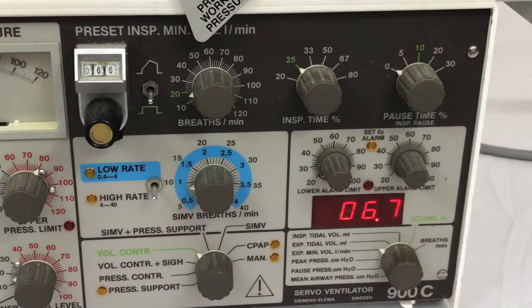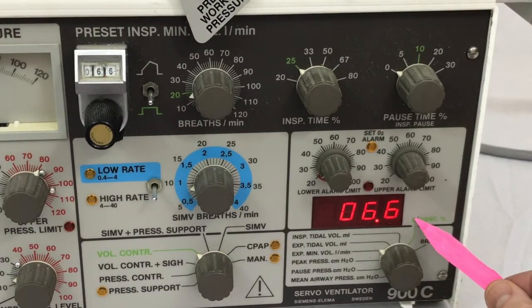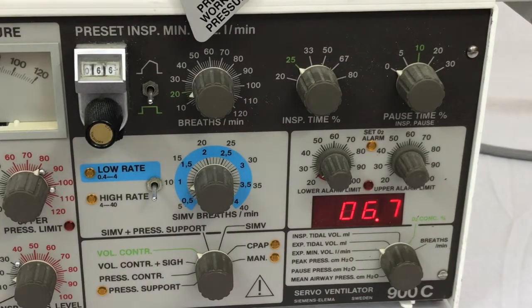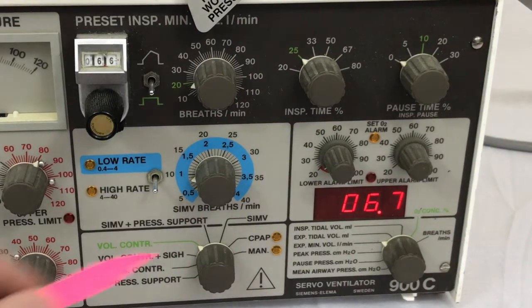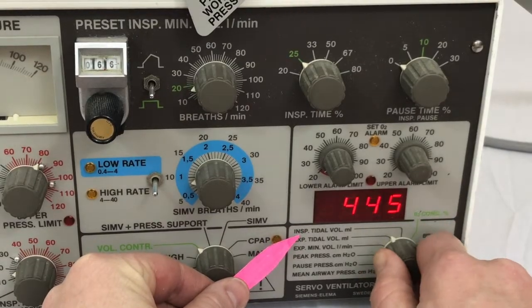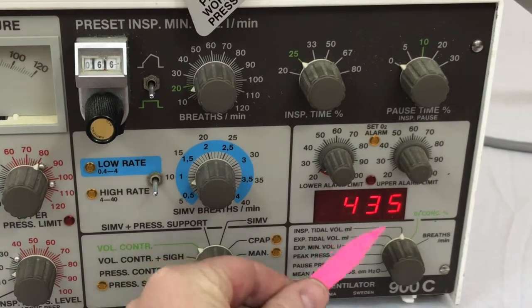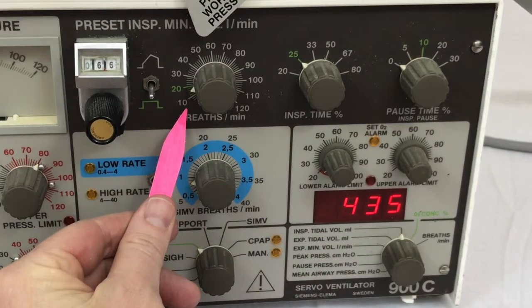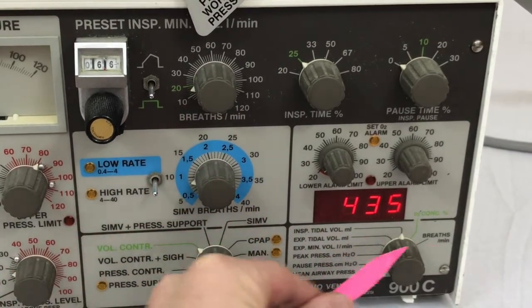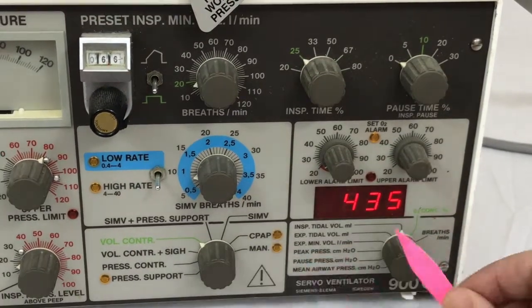Now let's put these settings into the ventilator itself. As you can see, my measured display for my measured minute ventilation is 6.7. That's my precise minute ventilation I'm trying to target. And as you notice, though, I scroll to my tidal volume and it's 435, and I want to set a tidal volume of 400. I'm pointing out my breaths per minute, and that's how I'm going to set my tidal volume.